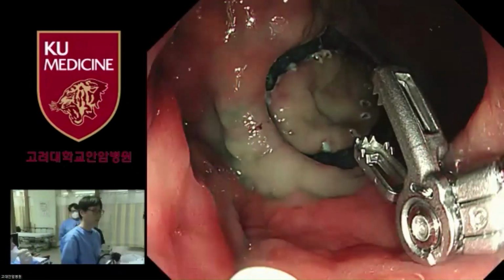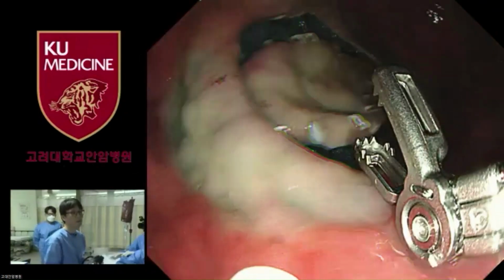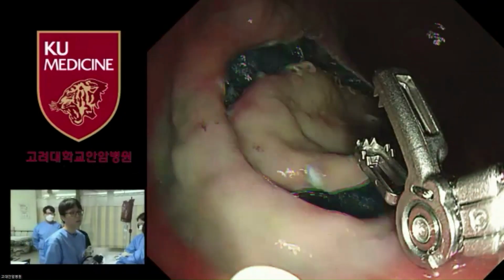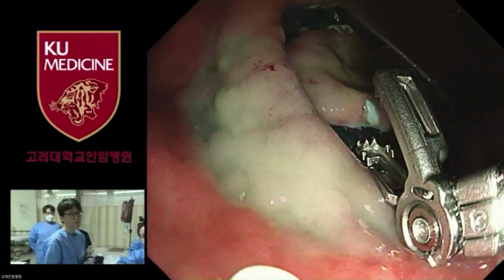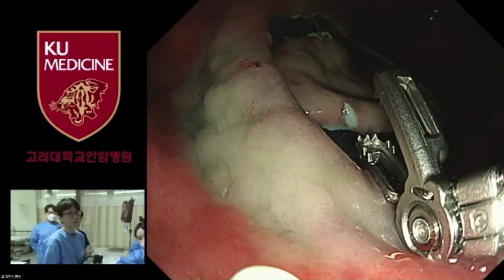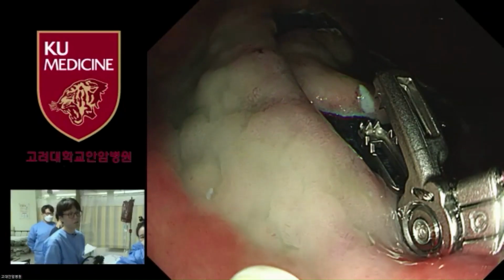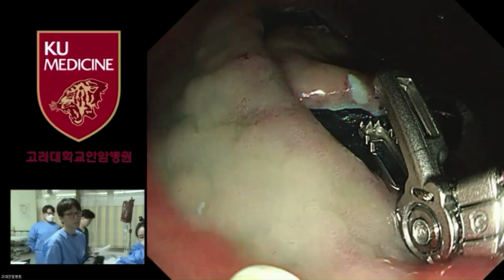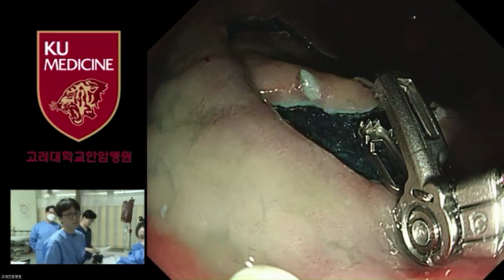Can you start? Yes. I'm going to start the dissection. As you can see, the mucosal flap falls down to the base. So it is highly recommended to grab the mucosal flap to expose the submucosal plane. Then I'll start to grab the mucosal flap.